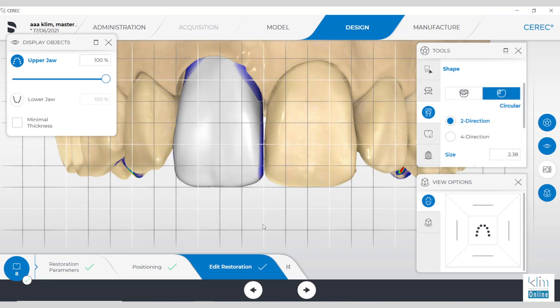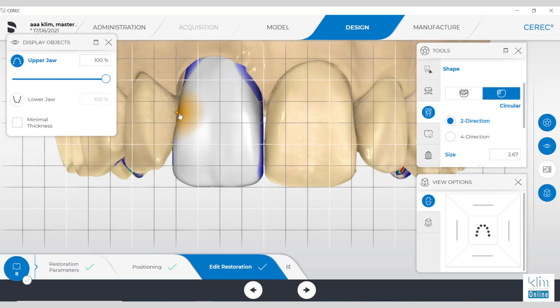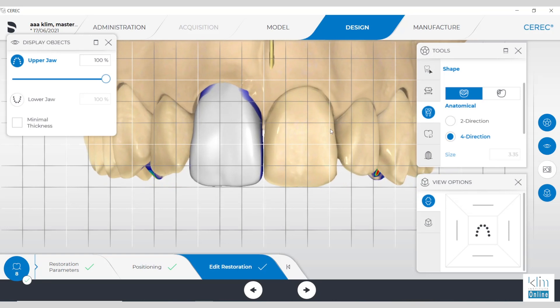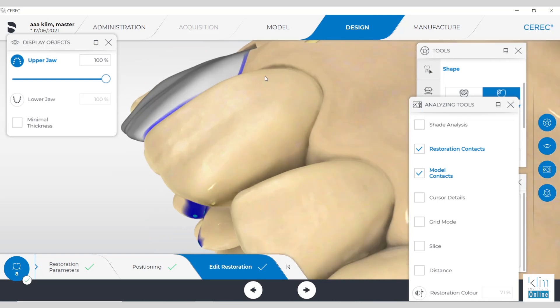I stay away from that position tool as much as I can because it messes up the emergence. Proceed with the silhouette refinement using the two-directional circular tool — small motions. Use the 2D grid and those cells within the grid for dimensional alignment to the adjacent central. It doesn't have to be a perfect match or perfect symmetry, but we do want to keep it in harmony. I like that view option to keep that reference for our incisal edge and the length.